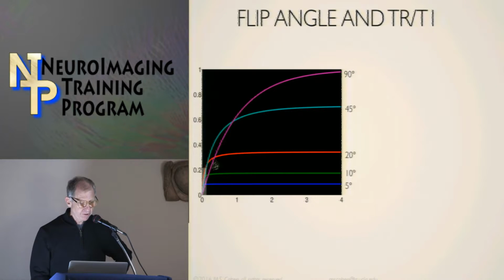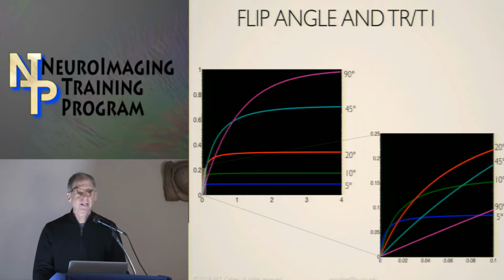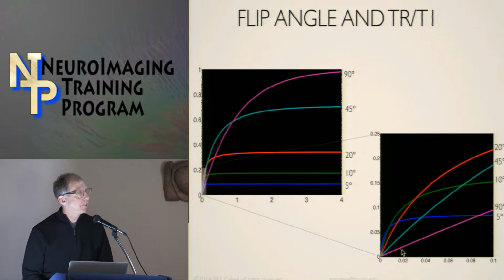And so on as you go to shorter and shorter flip angles. And when you start to get to really, really short TRs, tiny fractions of T1, say a tenth of T1, you will have, at 20 degrees, 3 times as much signal as you would have with a 90-degree RF pulse. And when you get even shorter, you might have dozens of times higher signal by choosing a flip angle which is smaller than 90.